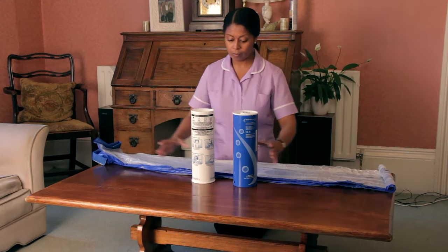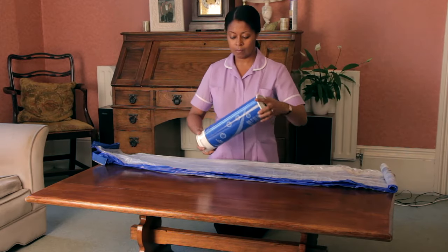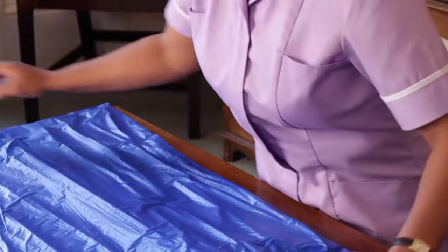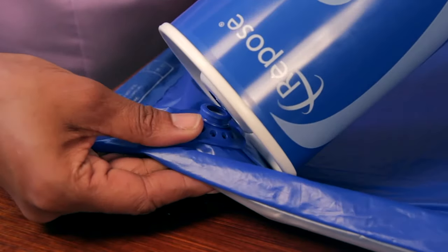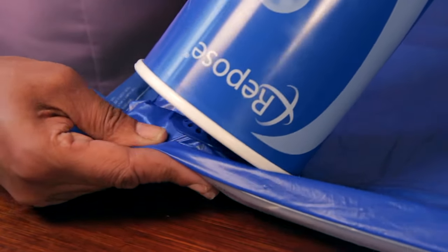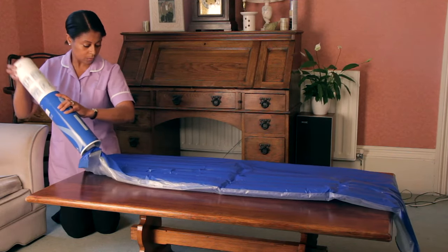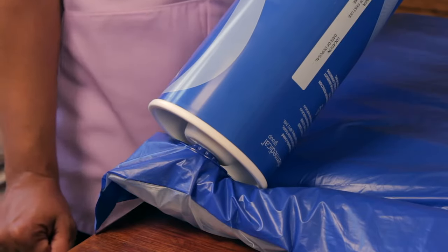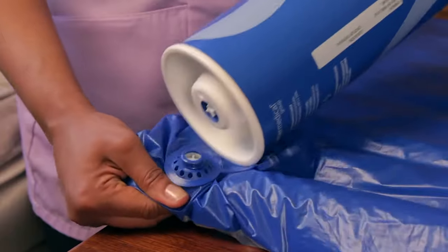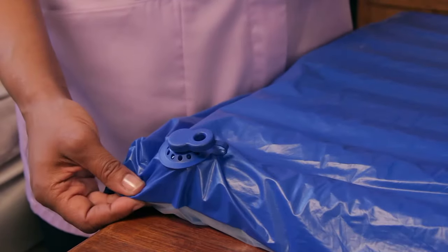First, remove the Repose Contour from the tube. Refit the two tubes together to form a pump. Connect the valve on the pump to the valve on the Repose Contour. Inflate the repose until you hear air exhausting from the pump valve. Stop pumping and wait until you can no longer hear air escaping. Cover the valve on the contour product using the solid end of the valve cap.